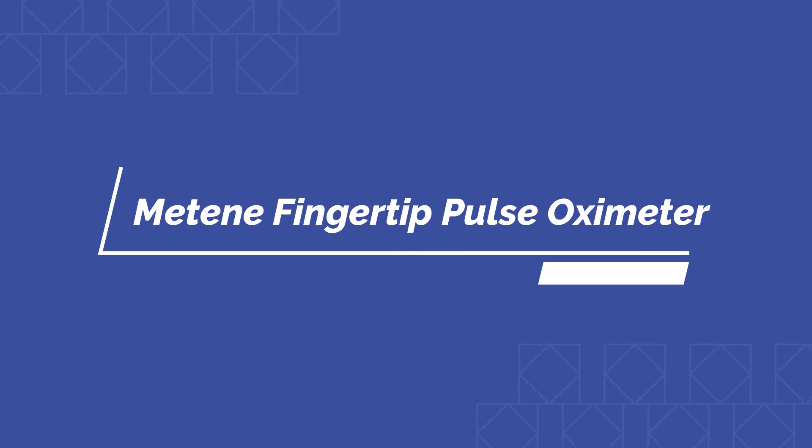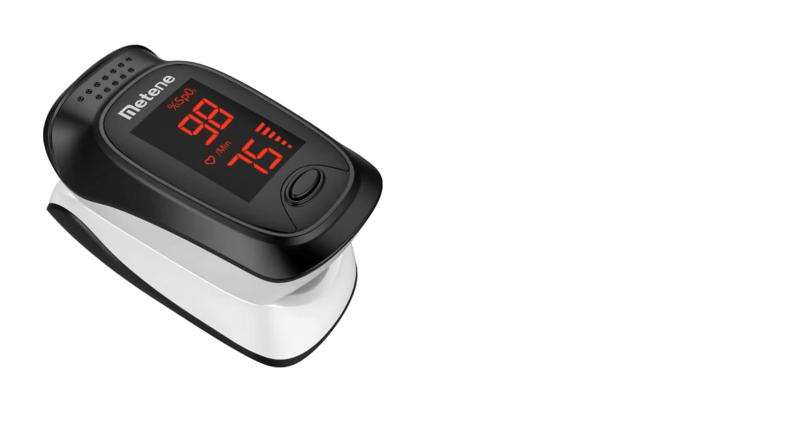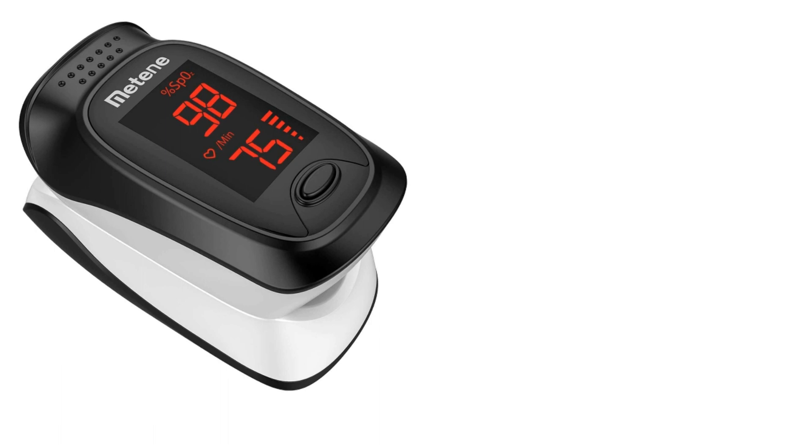Number 2 on the list is the Metene Fingertip Pulse Oximeter. It is lightweight and very portable, with a carrying case featuring a built-in belt loop, making it easy to take with you all day. Using one button to activate the device, you can measure your blood oxygen saturation level and get a clear reading in about 8 seconds. It also comes equipped with an alarm and flashing screen to alert you when a reading is out of range. Two AAA batteries and a lanyard are included.